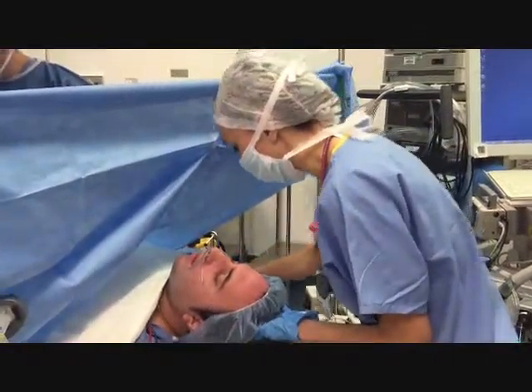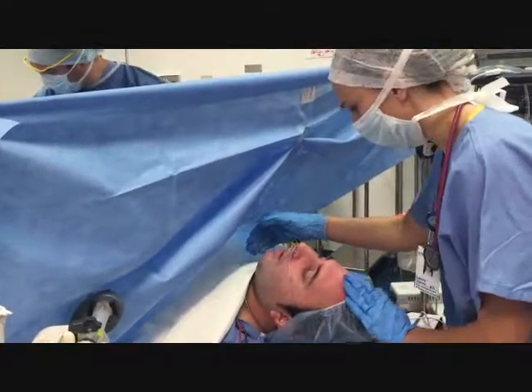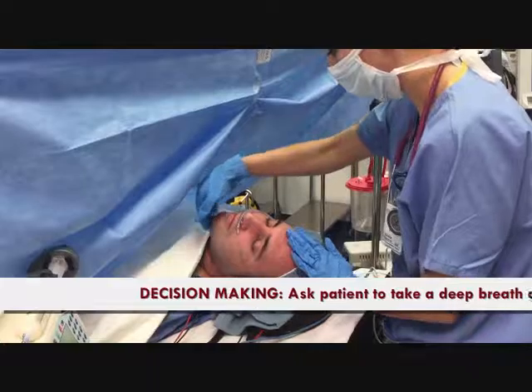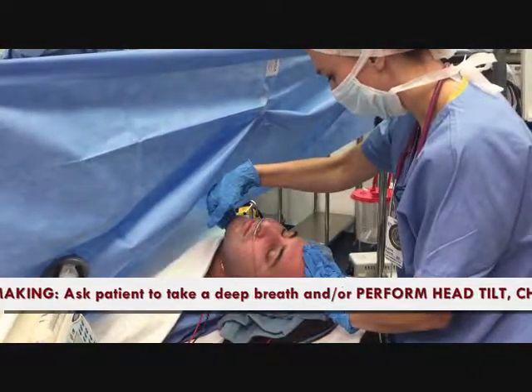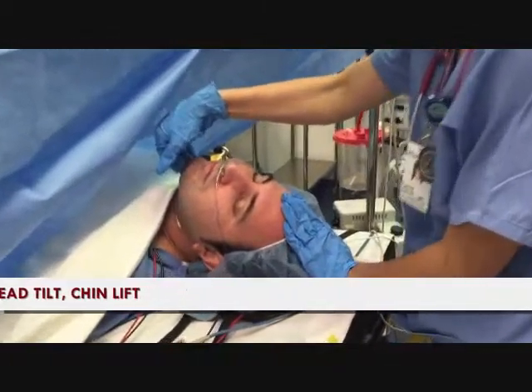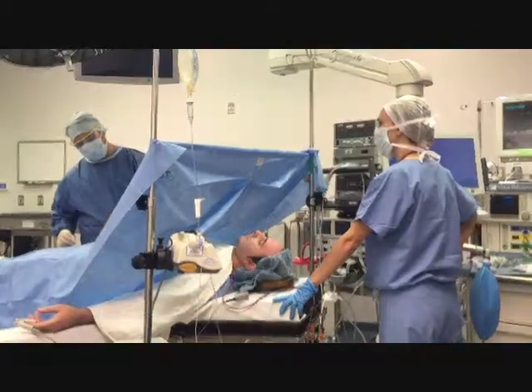Mr. Jones, take a nice deep breath. To limit the fluctuations of the end-tidal CO2 waveform, the appropriate decision making is to ask the patient to take a deep breath and or perform head tilt and chin lift. Patient may feel this a little.